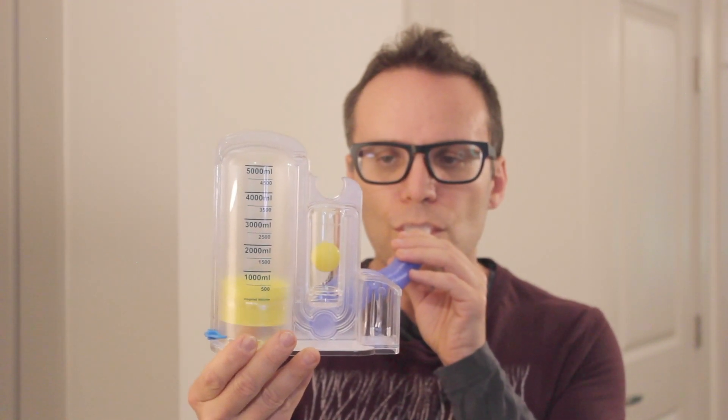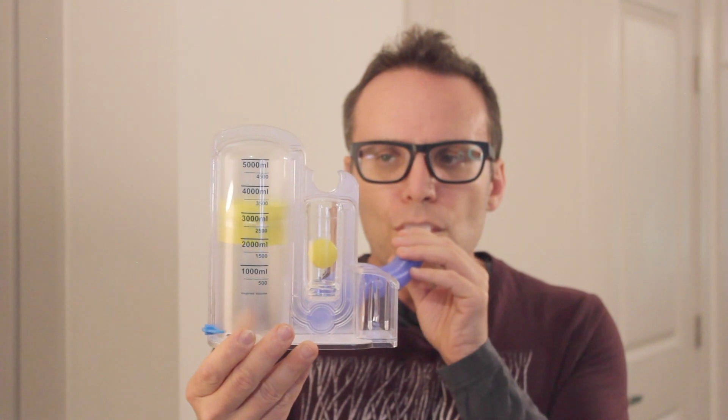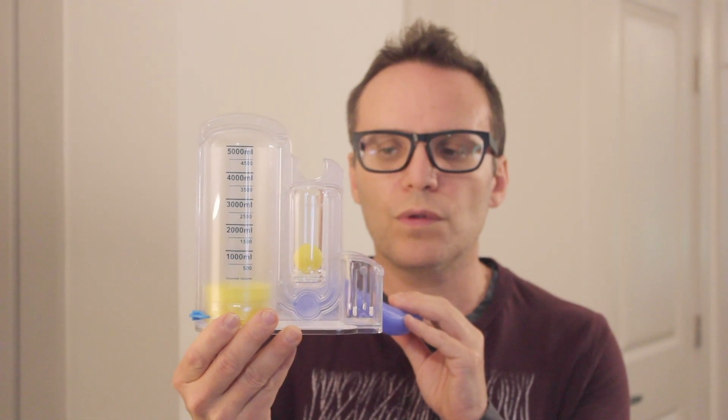Exhale normally. Let's complete a full exercise session. Breathe in at a moderate speed while trying to raise the volumetric piston as high as possible. Once the piston is as high as you can raise it, hold your breath for five seconds or longer. The piston will slowly descend back down the Spirometer. When it's resting on the bottom, you can exhale slowly.